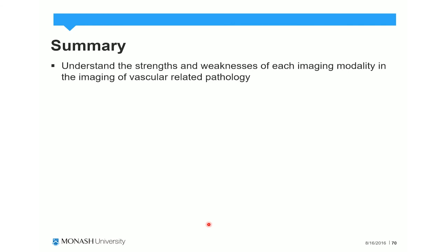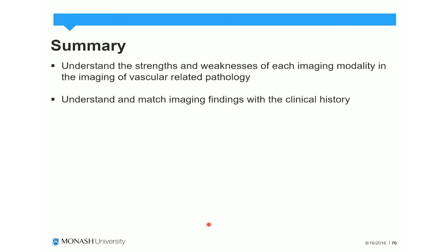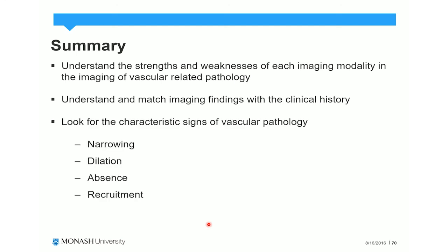So to summarise this presentation, it's important to understand the strengths and weaknesses of each imaging modality in the imaging of vascular related pathology. You must understand and match the imaging findings with the clinical history, because there can be various indications and demonstrations of pathology on each modality.